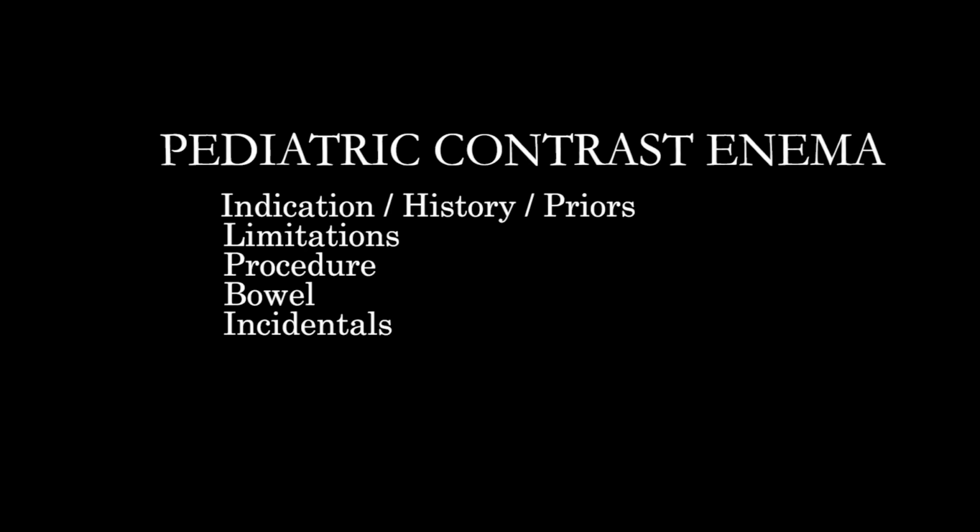This is a study that's done in a few scenarios. The most common, or the one that people generally think of, is in a neonate when you're concerned about distal intestinal obstruction. So the classic differential here applies. People are thinking about Hirschsprung's disease, functional immaturity of the colon, also called small left colon, meconium ileus, and then uncommonly an ileal atresia.